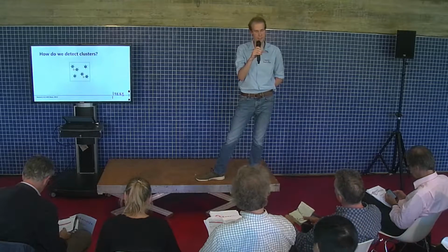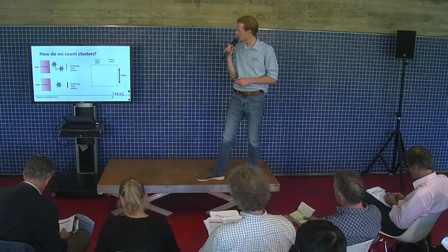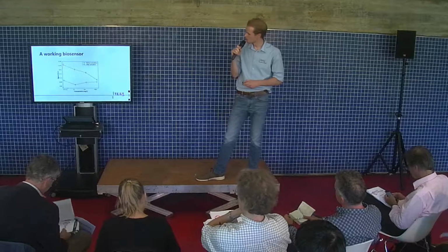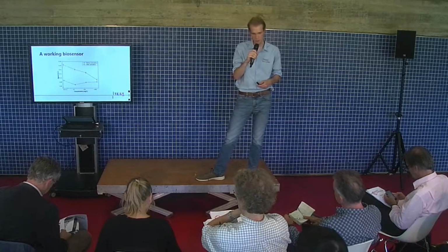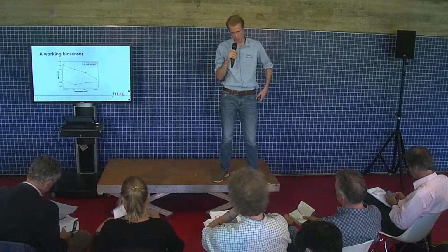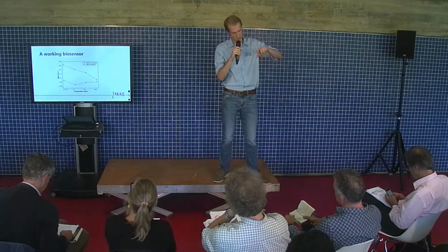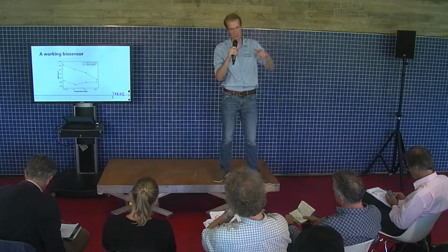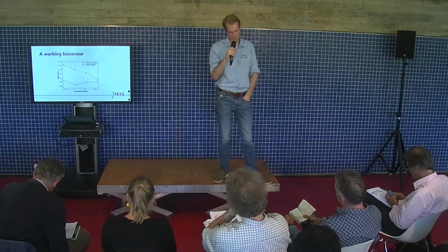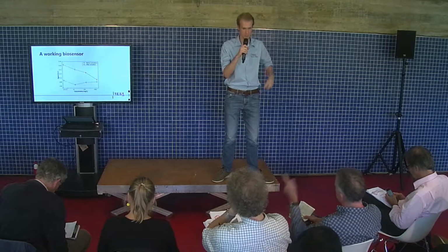Well, one thing that I did not mention, when you look at the graph at the end, the dose response curve, you see the blue line without actuation, and the red line that goes down is after actuation. So the actuation of the sample means that before we start measuring, we do linear magnetic shots, and that brings the clusters, the beads, together, which speeds up the mass transport. So that fastens the assay. So we measure in minutes.